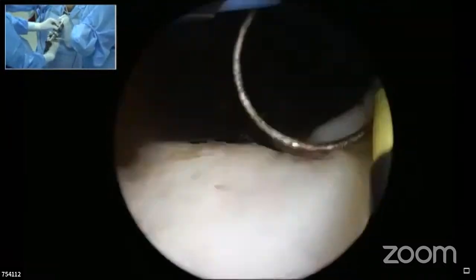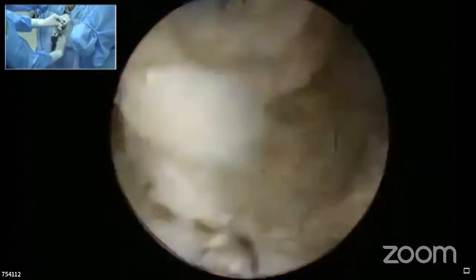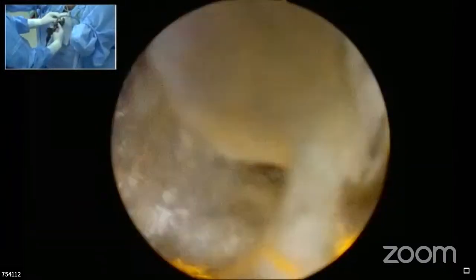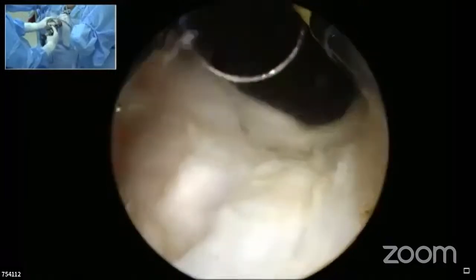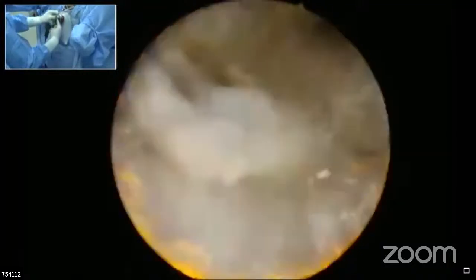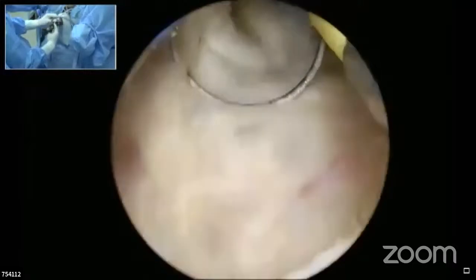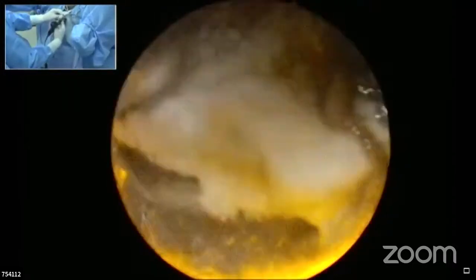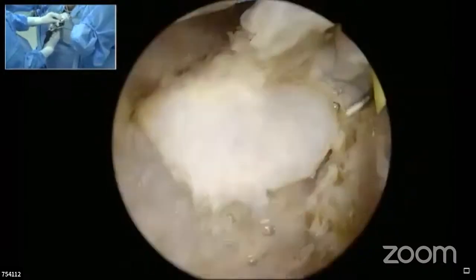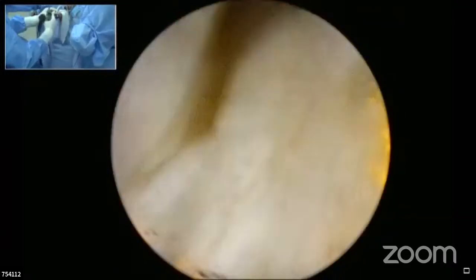So here we can go and debulk it more rapidly. So here, since there is no vascularity left, it would not make much of a pertinent difference practically as to what approach we do. The only thing that we have to keep in mind is not to lose orientation as to where we are resecting and have a quick debulking effect of the lateral lobe which has fallen. So we can notice there is hardly any vascular supply which is left. So it is akin to almost morcellating in situ the devascularized adenoma.